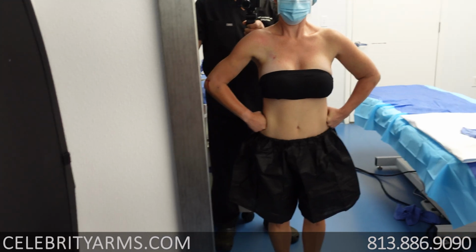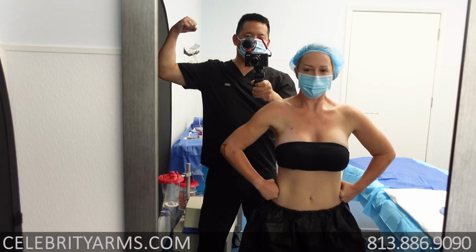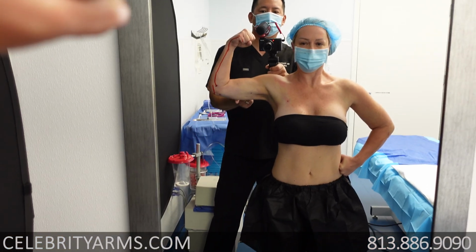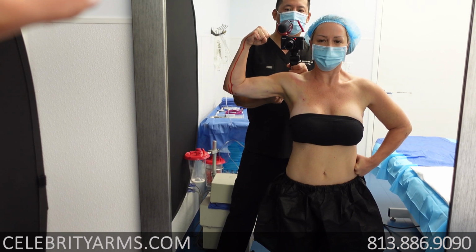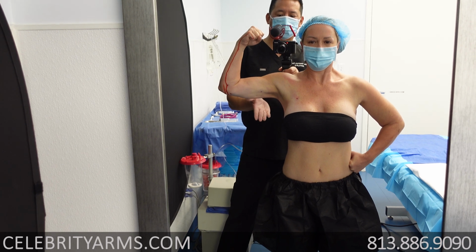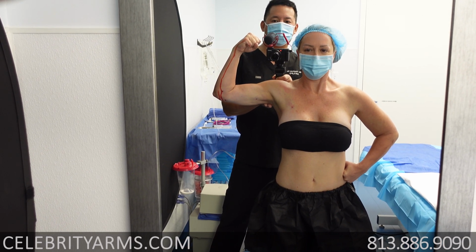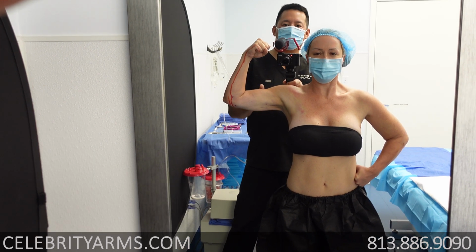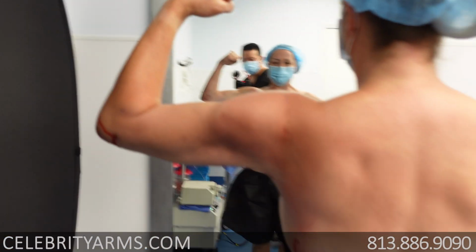This narrowing part of the delta. Scoot over just a little bit so we can get there. Let's do the muscle pose. Oh my God. Now keep it tight. Right here, we're right on muscle. Right here, we have about a third of an inch, and that third of an inch hasn't pulled up all the way yet. But overnight and with Renuvion, that's going to pull up even more. See how much more defined it's going to look with just that little bit? This is already as small as it can be. I'm just going to show everybody from the back side here.